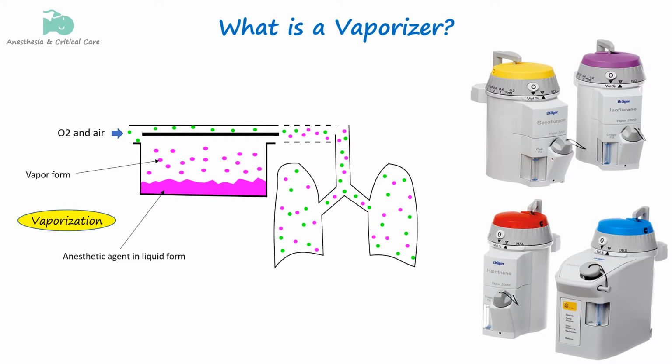anesthetized. In this video series, we will explore the physical principles behind vaporization, the working mechanisms of vaporizers and different types of vaporizer. Let's begin with the physical principles behind vaporization.